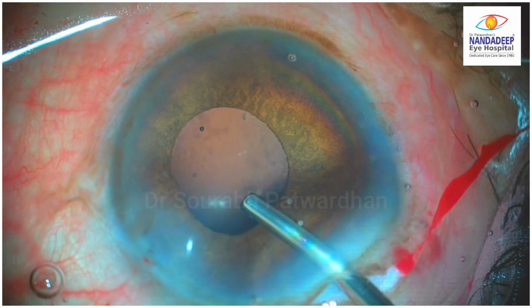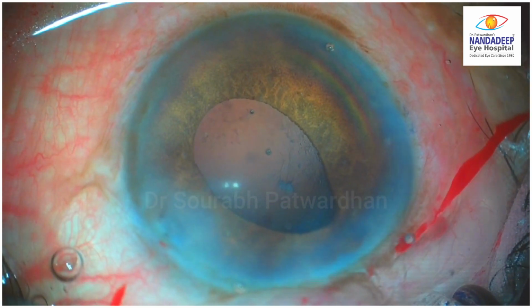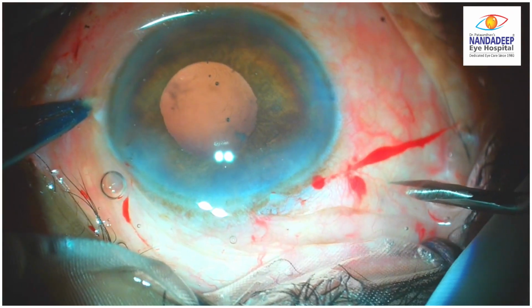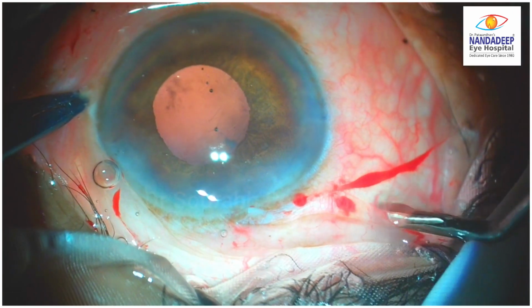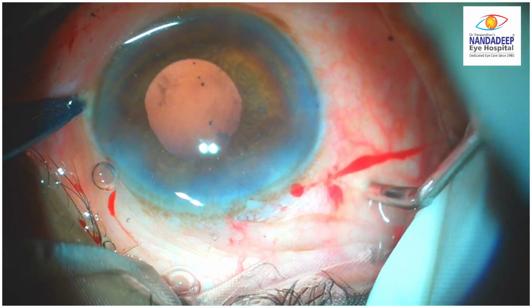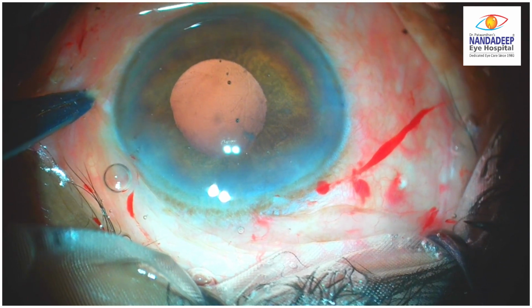Now again the surgery was handed over to a senior surgeon. The surgeon tried again to form the anterior chamber, where as you can see, as the OVD is pushed more, the iris starts prolapsing because the PC is bulging forward. So he decided to do a pars plana tap with a 23 gauge MVR here, and as the MVR goes in and comes out, you can see that the fluid which has collected in the Berger space just comes out. No need to do any aspiration here. The direction of the MVR was towards the center of the globe. That is important to avoid any damage to the posterior capsule.